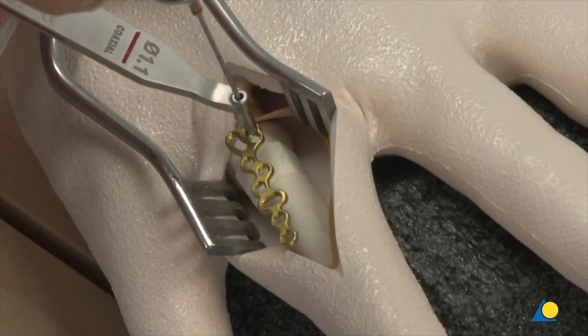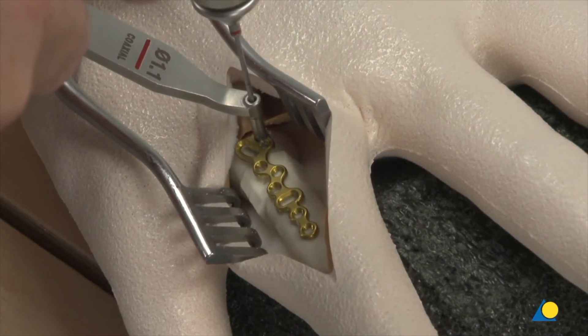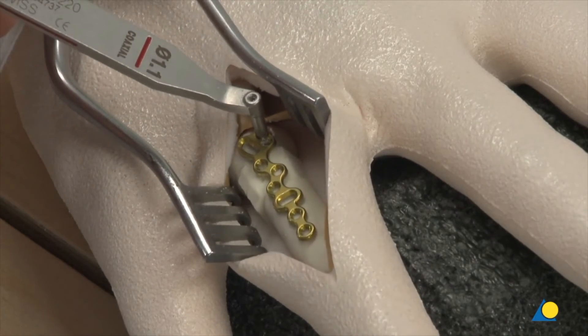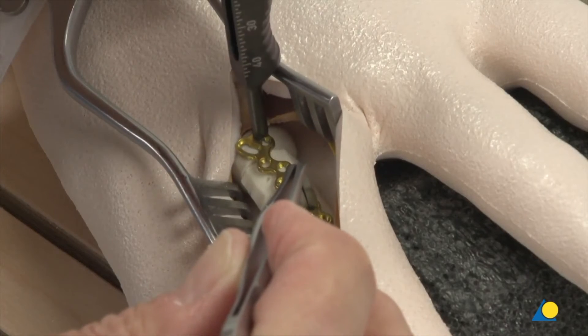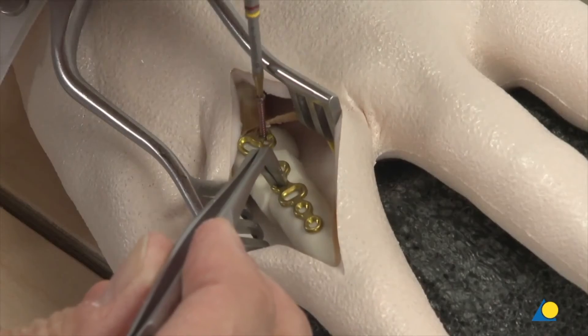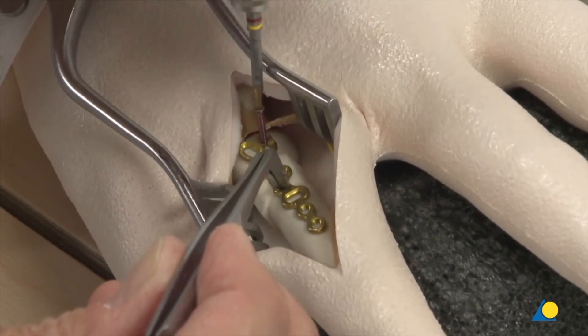The plate is placed on the bone and using the 1.1 coaxial side of the drill guide, the first screw hole is drilled with the 1.1 mm drill bit. The required screw length is measured with the depth gauge. The first variable angle locking screw is inserted but not fully tightened, which allows the plate to be adjusted by pivoting it.